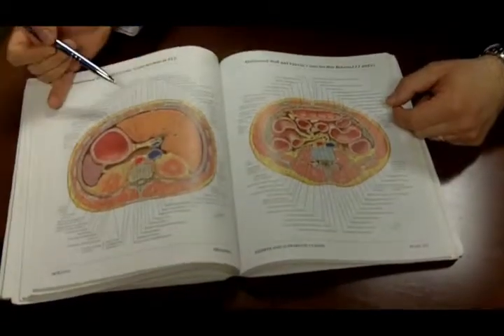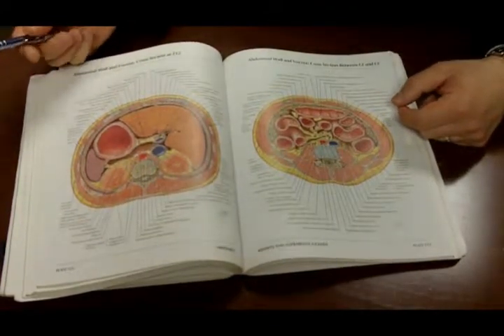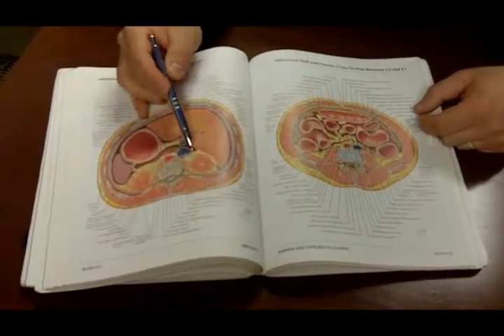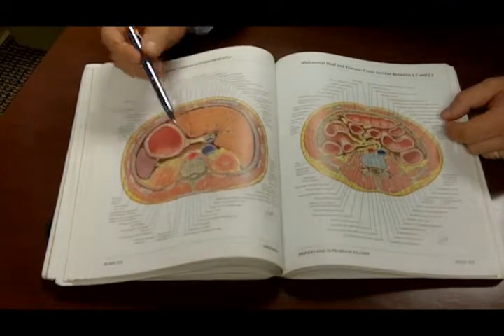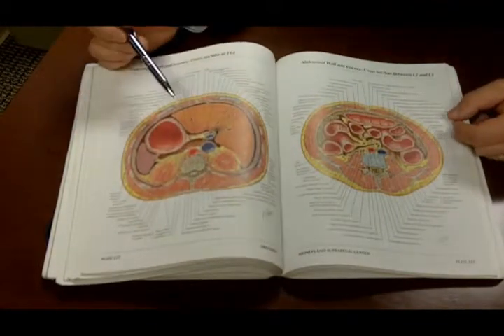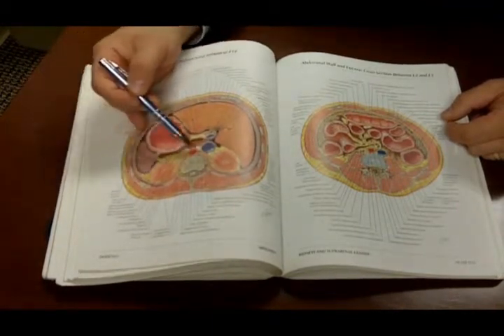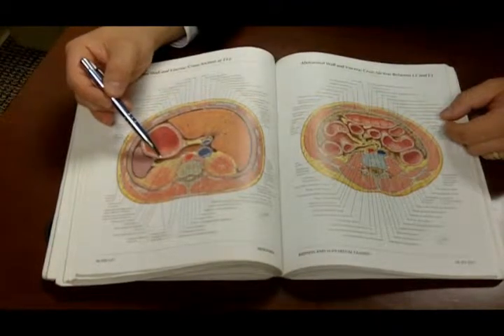So this is a typical cross-sectional image through a patient's abdomen at the level of the kidneys and adrenal glands, and the adrenal glands are visualized here and here. And as you can see, to get to this adrenal gland through the front, the typical approach for a laparoscopic adrenalectomy involves mobilizing all of these structures here, which are, in this image, the spleen, the stomach, and the pancreas.